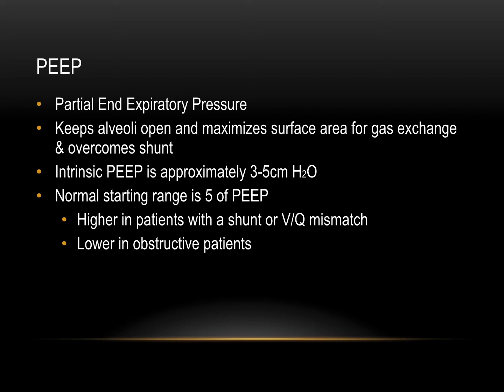So the best way that I can describe PEEP to you is if you imagine a balloon that we filled with water. We're going to have a water balloon fight.